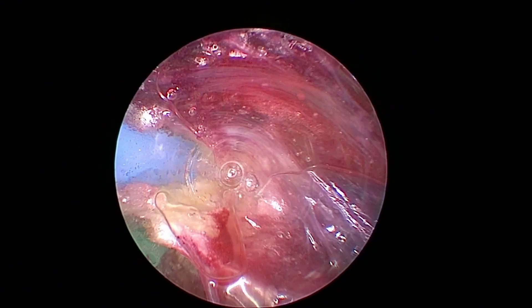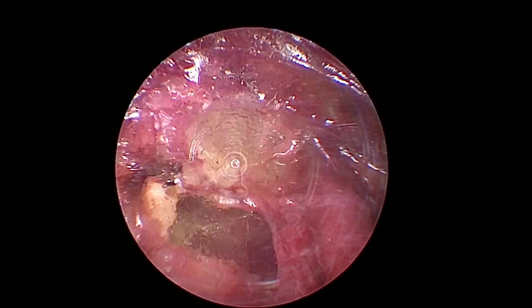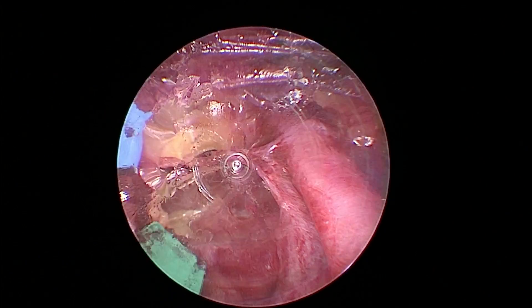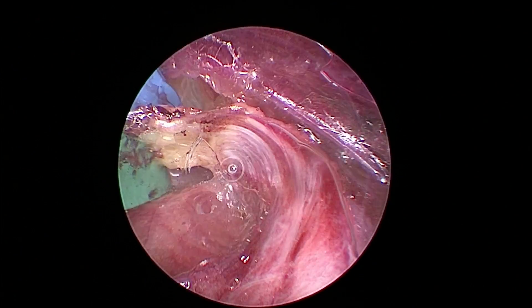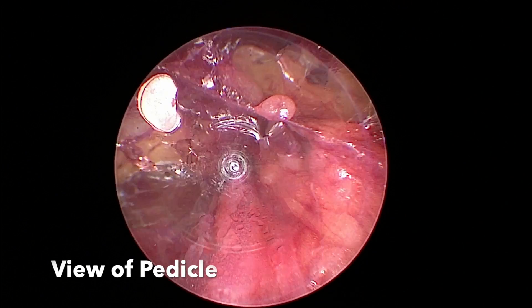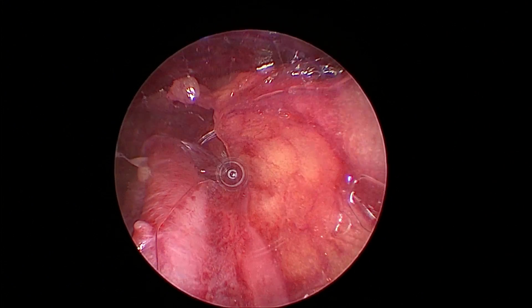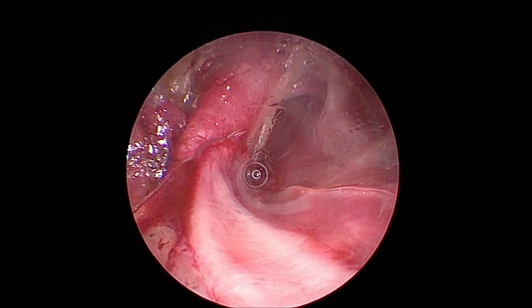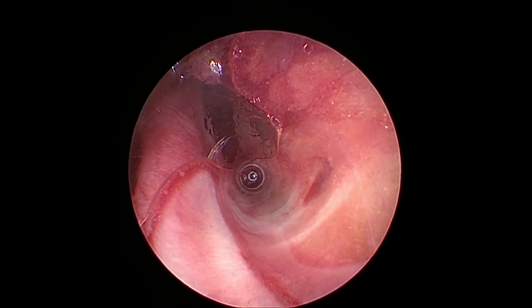I've cauterized the branch and I'm going to back out a little bit and make a better window, then finish taking that branch and that tissue. You can see the vein paired with the artery is intact and I'm lateral to that. Here's a good shot of the pedicle with the radial and the veins on both sides. You're always doing your dissection lateral to the veins and making windows, then taking the branches as you see them.